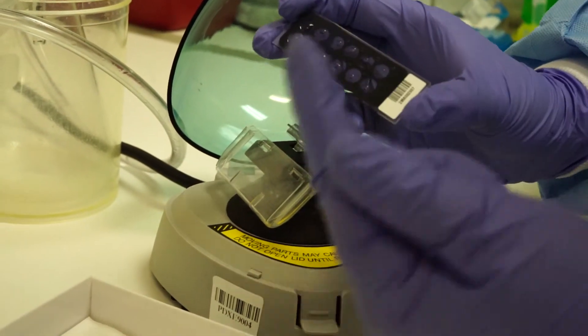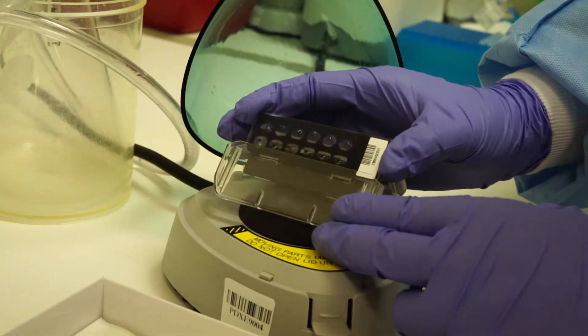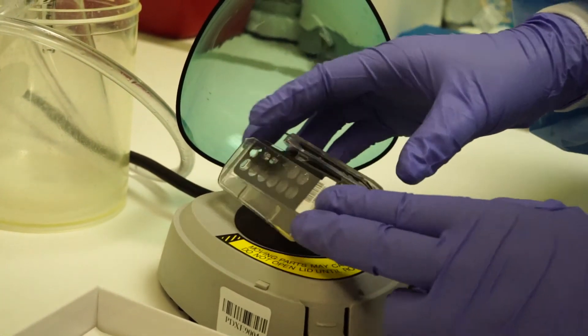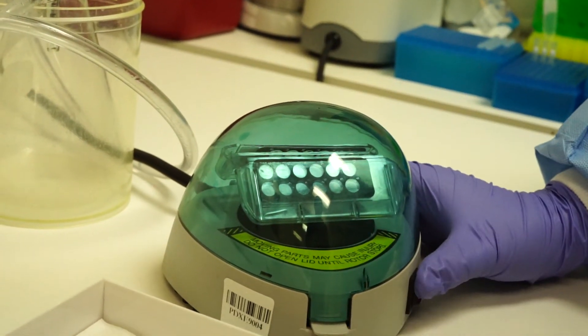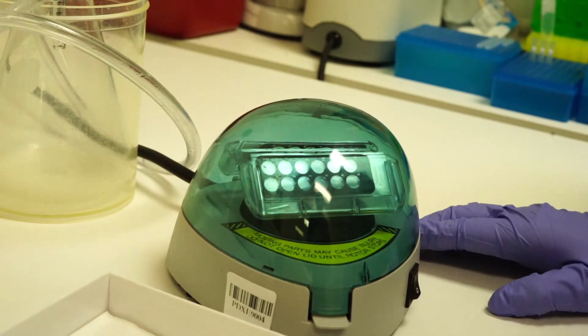Make sure the array faces out and load carefully. There should always be a blank loaded for balance. Close the centrifuge and allow to spin for 30 seconds.